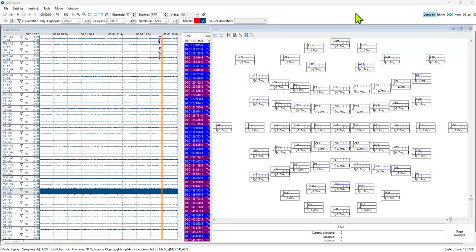So how to handle the raw data and ERPs in both views. Firstly, we have one noisy channel, which happens when you have a lot of channels, especially after some time, something happened to the material, etc. Or in this case, I think the cap is not falling uniformly, and this is slightly in the air, so to say, so it's not touching the skin.